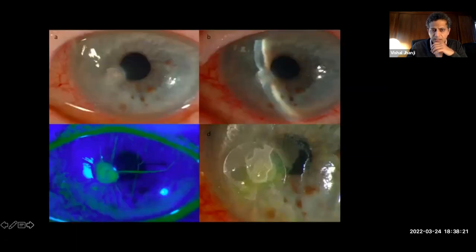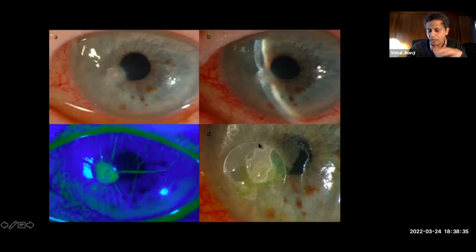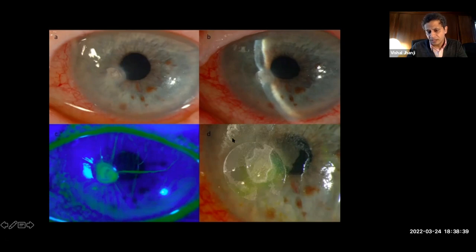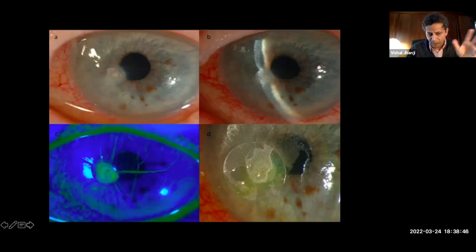The edge of the Weck-cel sponge is dipped in lignocaine gel or erythromycin ointment. Once that is done, the plastic disc sticks to the edge of the Weck-cel sponge. The other side of the disc, facing the eye, is dipped into a small well containing cyanoacrylate glue, and the whole complex is then put on the cornea. It sticks immediately, and looks very clean as opposed to the big mound of glue we sometimes create. You can do more than one disc if needed. The disc stays on the cornea with the glue for as long as you plan to keep the glue on the patient's eye.